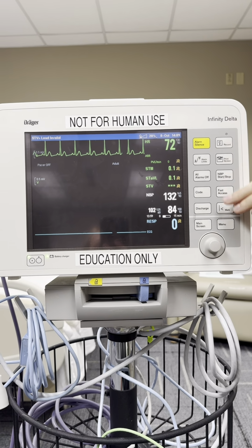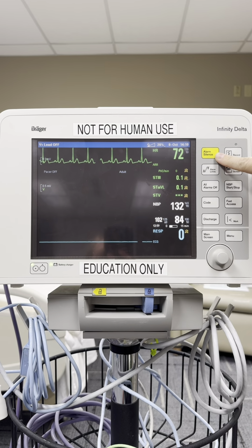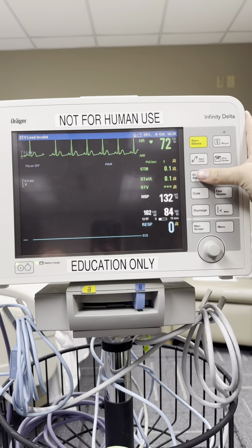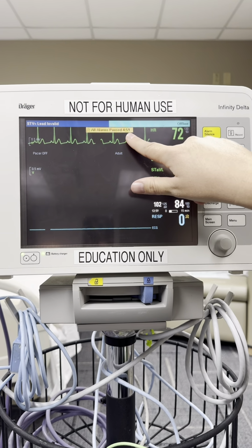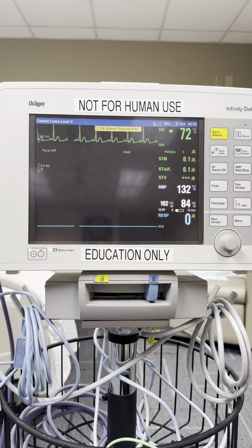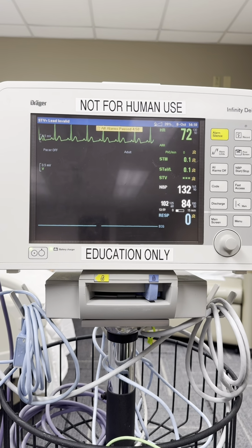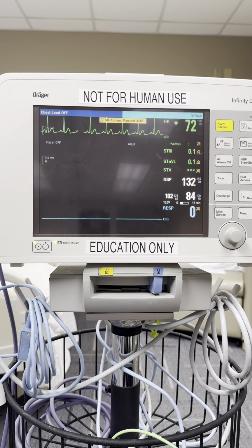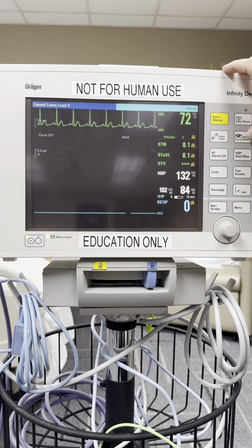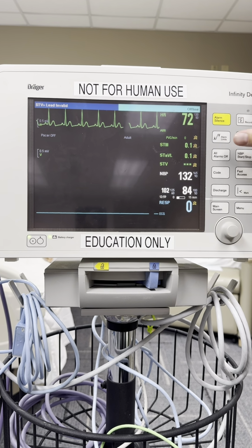Okay, we'll go through the buttons on the side. The alarm silence button will just silence the alarm that's currently going off. The all alarms off button, if you hit that, it will silence all alarms for 5 minutes. Be careful using this, as you can miss things if you walk away from the bedside. Then the patient won't be monitored as well. So just keep that in mind. If you're walking away, then you need to turn that back off so that it will alarm if they go out of the parameters that are set.